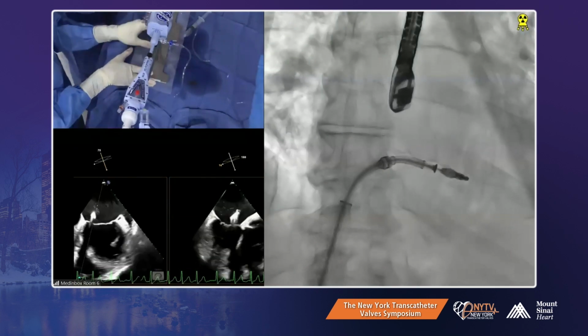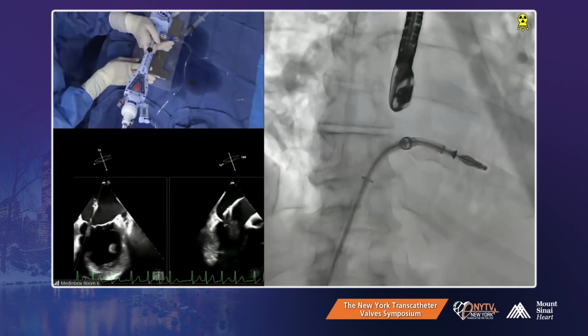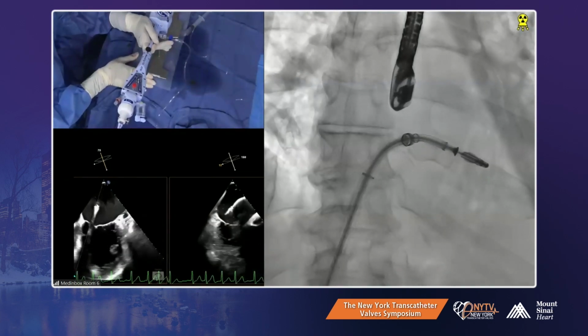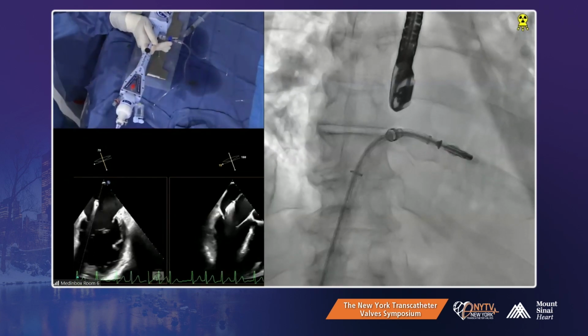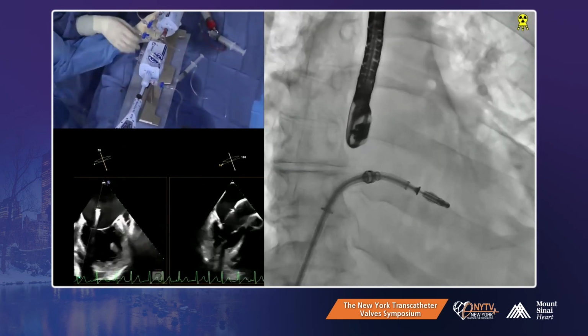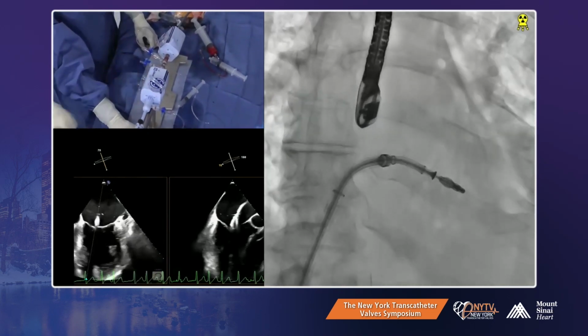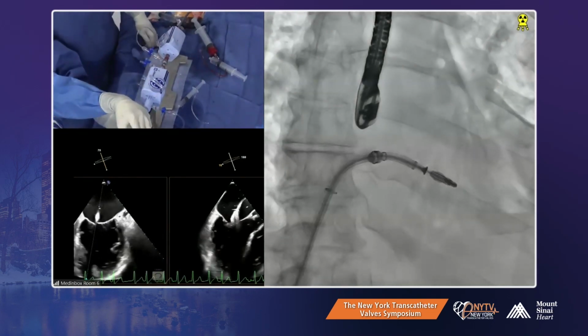Okay, that makes us more medial. So we just have that the other way. You're too medial. So just advance the stabilizer to make it more central for us. Okay. Anterior. So this looks better now, I think. Yeah, look at this. I think that's almost better. We have a lot of that looking like 4 o'clock.